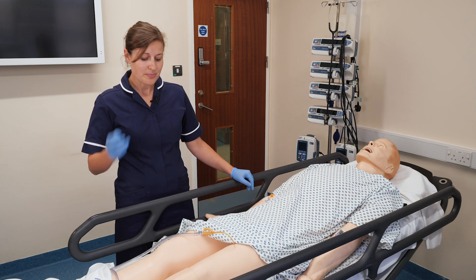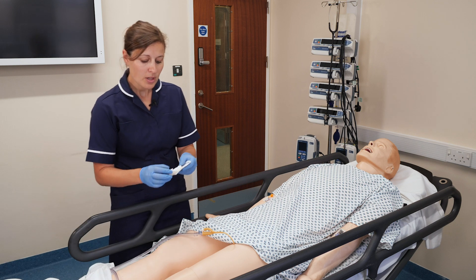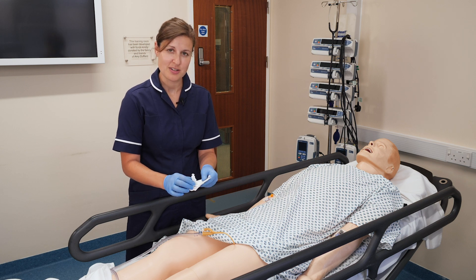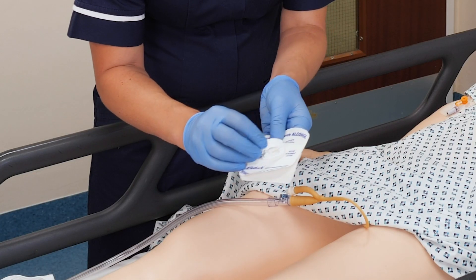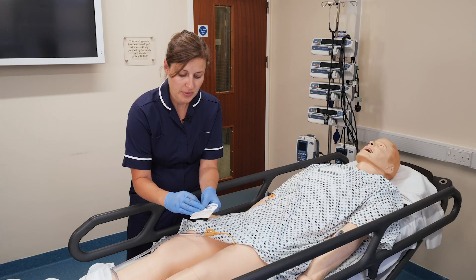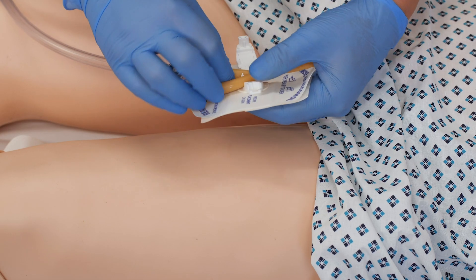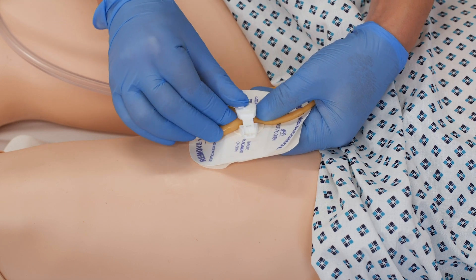The stabilization device I'm using - a good tip is to always put the catheter in here before applying it to the patient. There's an arrow on the device which basically points to the patient, so you insert the catheter and you can see that it sits snugly in there.